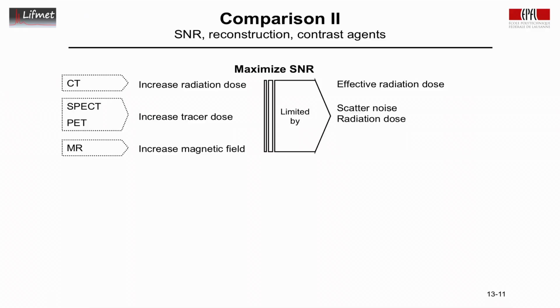Therefore the dose is limited by these kinds of events. We have only a finite coincidence interval for PET. We cannot go to infinitely short coincidence intervals, and at some point the randoms and the scatter will take over the gains in sensitivity from increasing the tracer dose, and it goes down. So there is an optimum sensitivity that one can get. And for MR, it is limited by the equilibrium magnetization through the Boltzmann distribution. Those are the limits there.